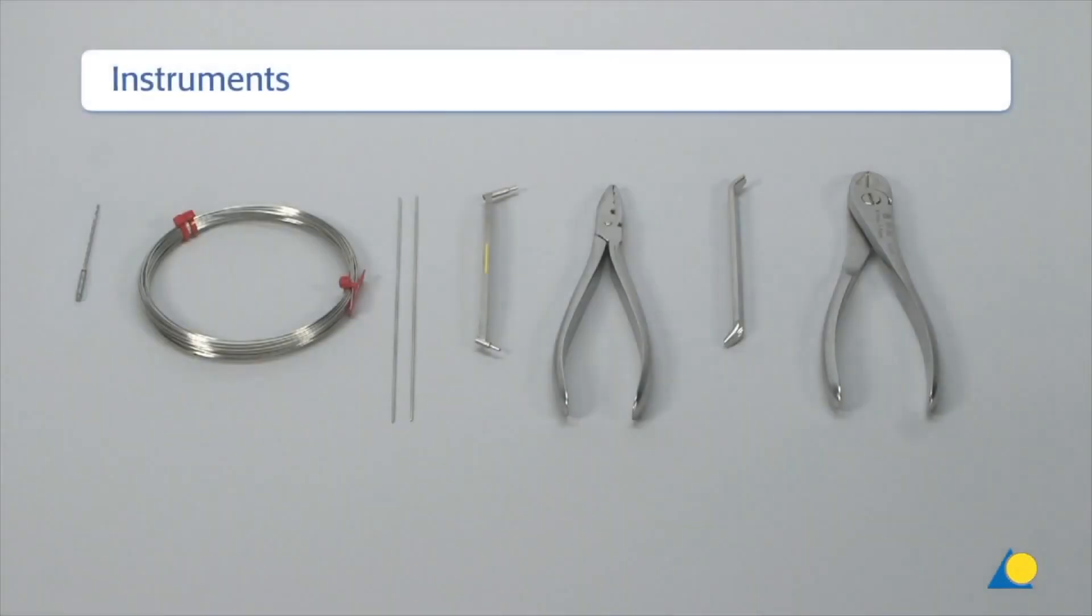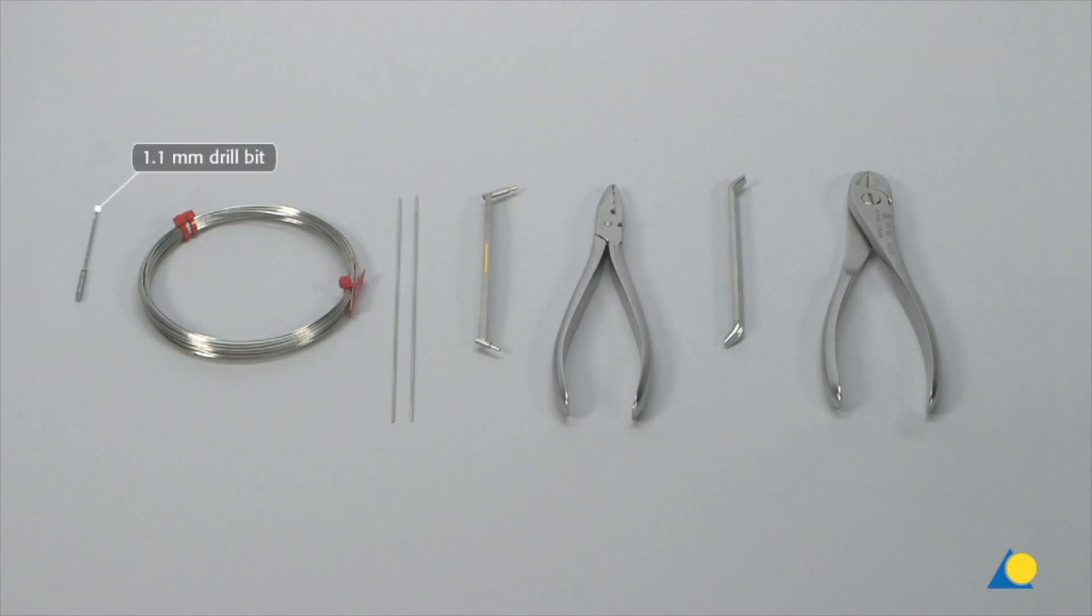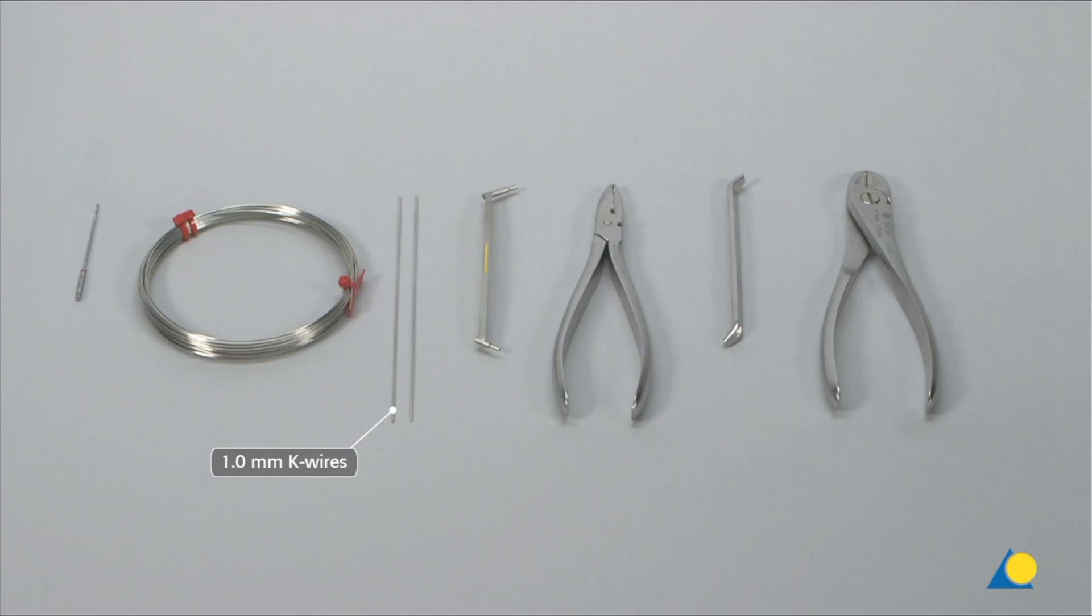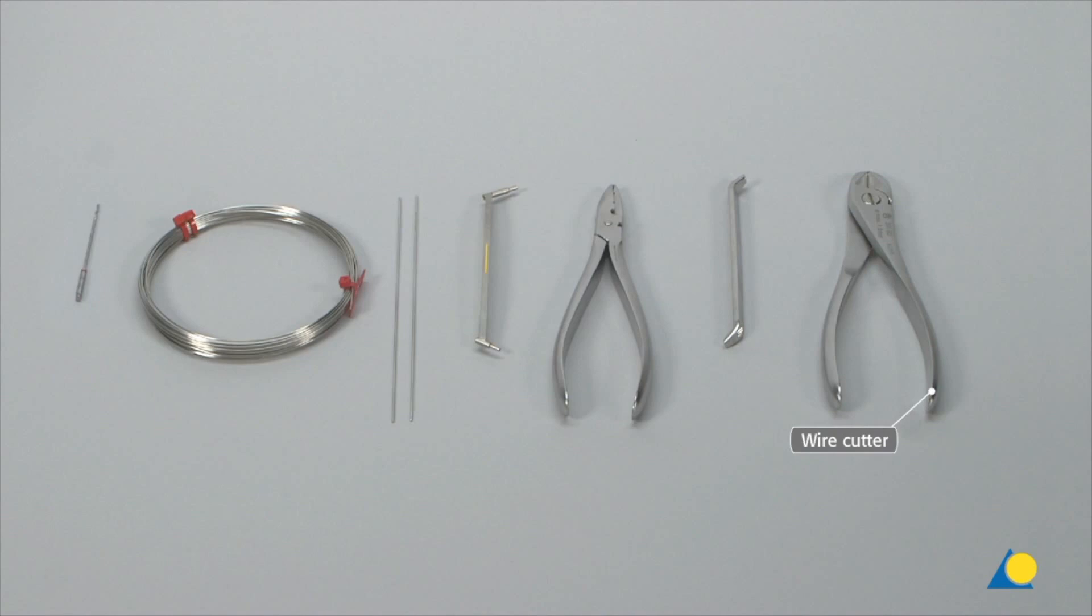The required instruments for reduction and fixation are the 1.1 mm drill bit, the circlage wire, two 1.0 mm K-wires, the 1.3 1.0 double drill guide, the wire bending pliers, the bending iron, and the wire cutters.